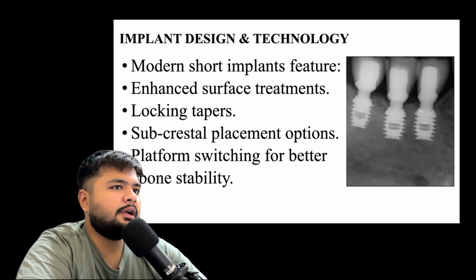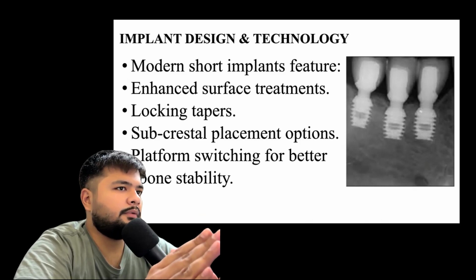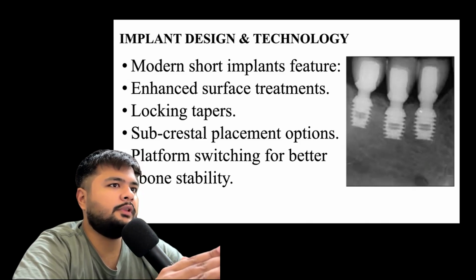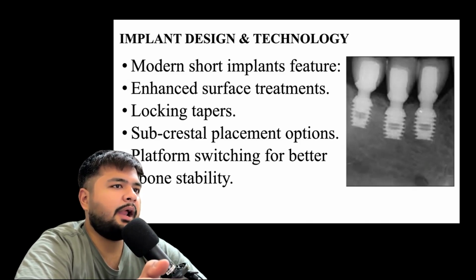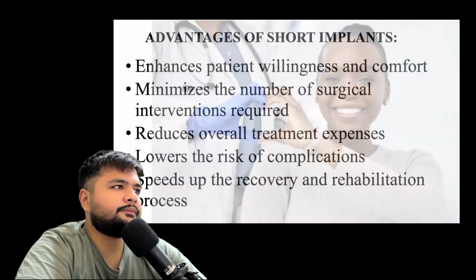Basically, when the abutment over the implant has a narrower diameter compared to the implant body itself, it causes a reduced inflammatory response on the crestal surface of the implant margin or the bone margin, which increases the success rate of the implant by decreasing the peripheral or marginal bone loss, which occurs uneventfully every year.